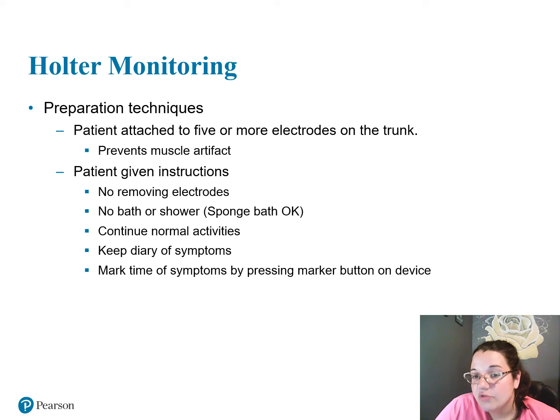Can they continue normal activities? Yes. Should they keep a diary? Yes. And mark the time, the symptoms, by pressing the marker button on the device. So basically, when that patient feels like they're syncope and they're about to pass out, what do they need to do? Press the button. What happens is it records their rhythm at that moment, so that when they go back to the doctor, they can say, I felt faint at this moment, and then the doctor can see if the heart is actually affected by it or not.